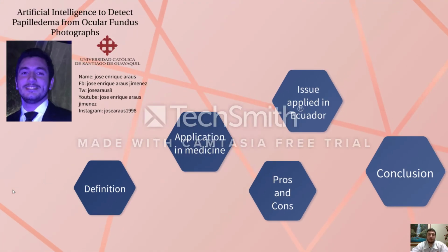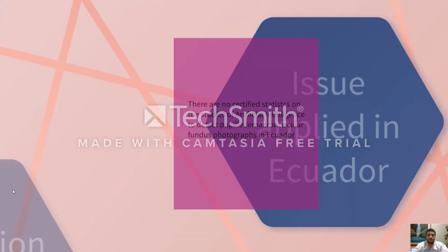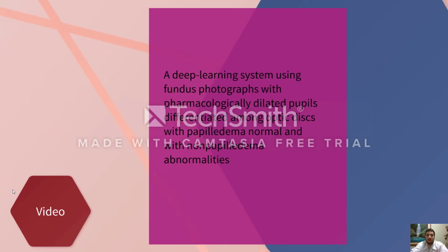Use applied in Ecuador. There are no certified studies on the use of artificial intelligence to detect papilledema from an ocular fundus photograph in Ecuador. And conclusion. A deep learning study used fundus photographs, with pharmacologically dilated pupils, to differentiate among optic discs with papilledema, normal, and not papilledema, abnormal.